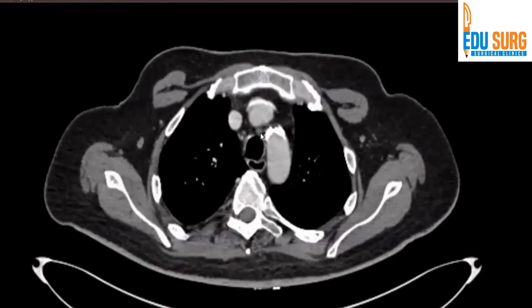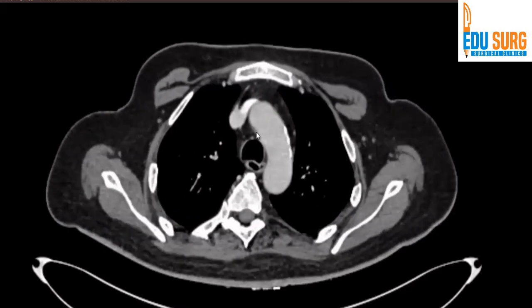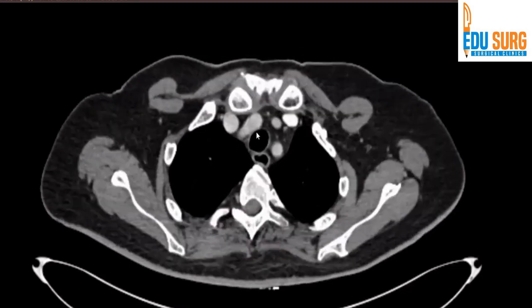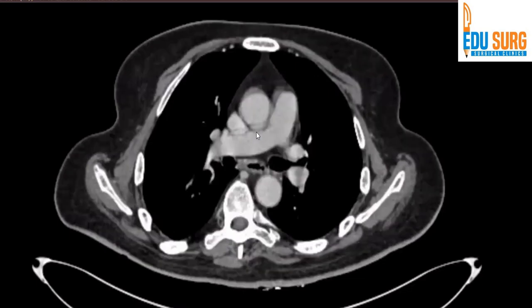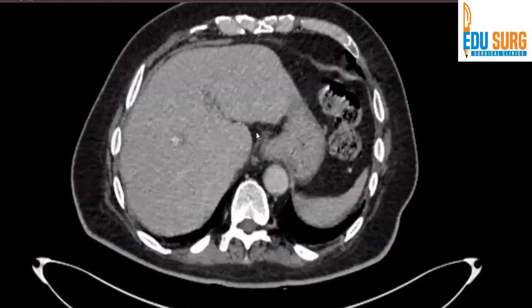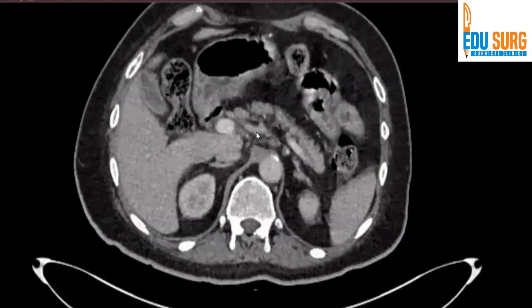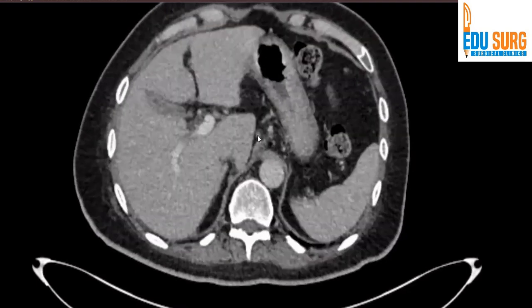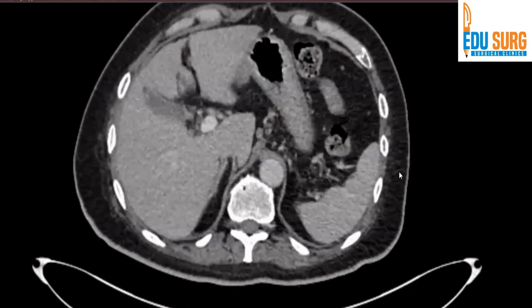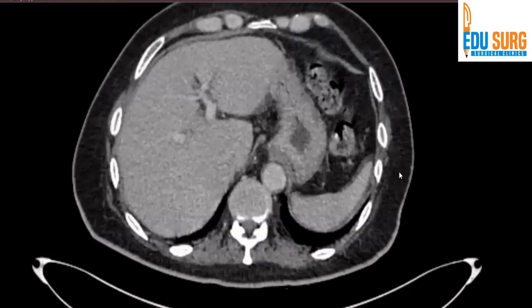Some other structures to note are lymph nodes. There is a pre-tracheal node — you can see a small node in this area. As we go down, there is a small node in the area of surgery. This is the node — it is a lesser curve node. So a lesser curve node is also present. The disease is bulky but the planes with aorta and cava are maintained.